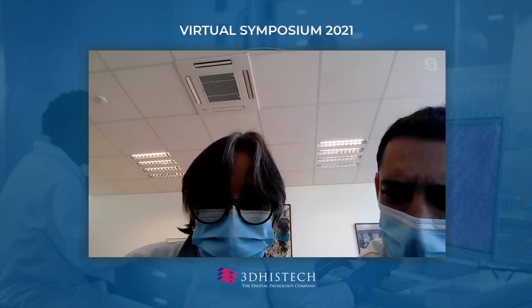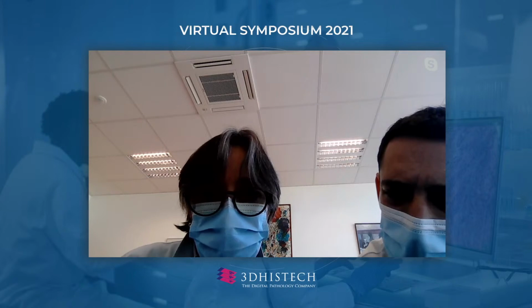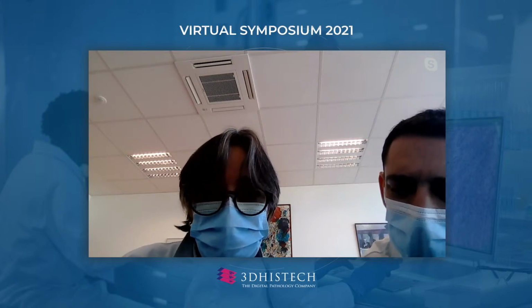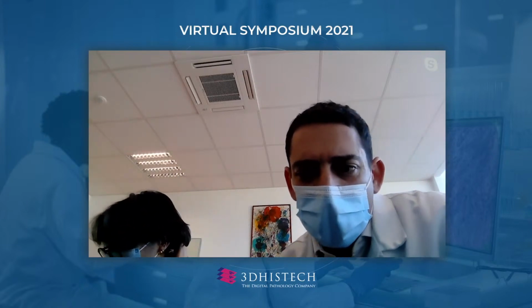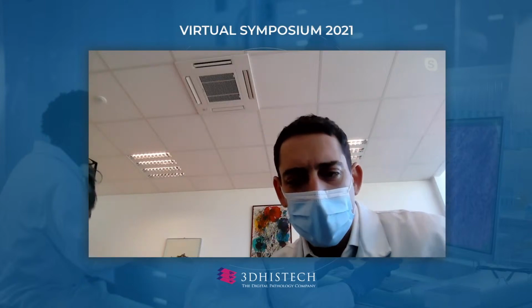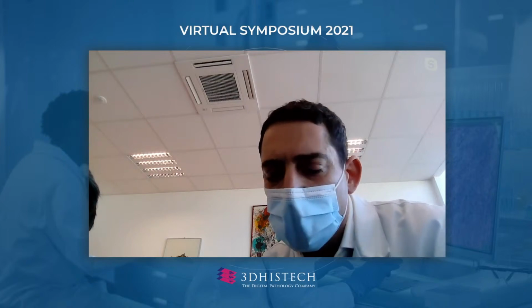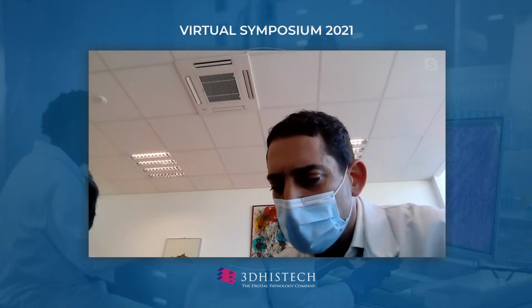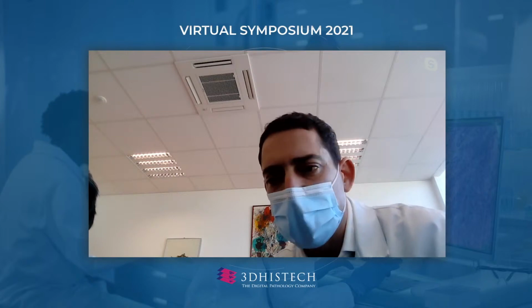The home pathology workplace. Did you evaluate special tools, medical microscopes? No. For home working, we have to use a very high quality screen, because you cannot watch a digital slide without high quality.